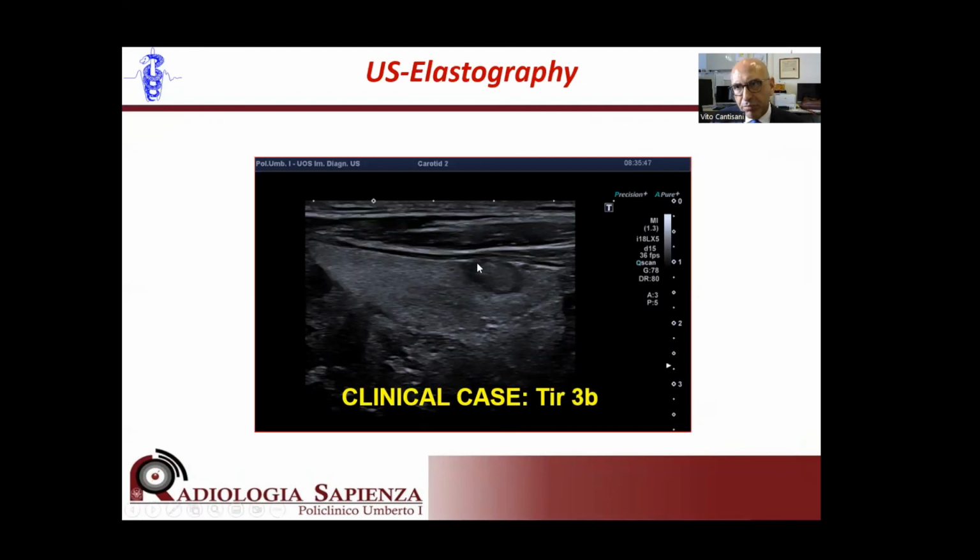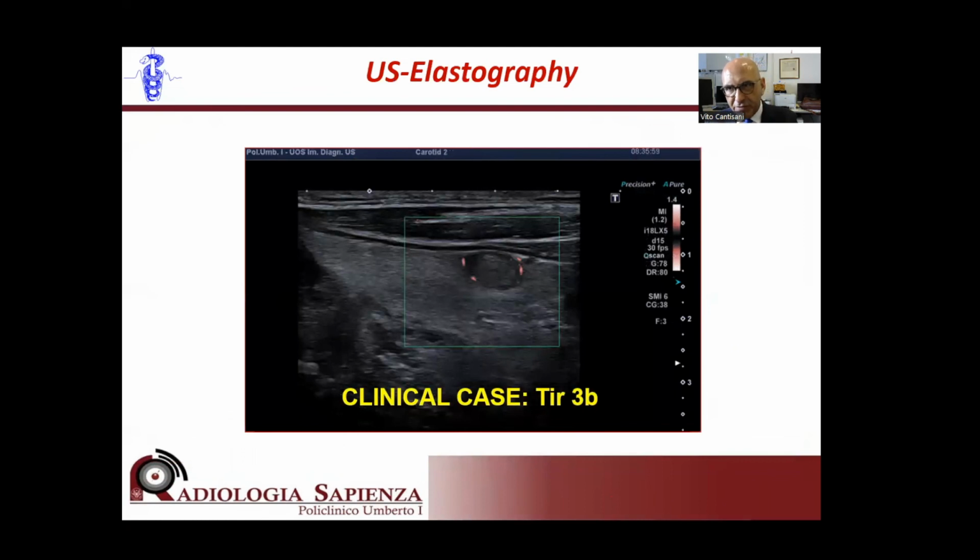Typical possible daily life case. The lesion is mildly hypoechoic compared with the other thyroid tissue. There is an asymmetry of the halo sign. Fine needle aspiration showed indeterminate results. The patient was scheduled for surgery.